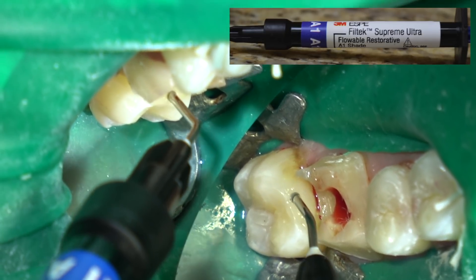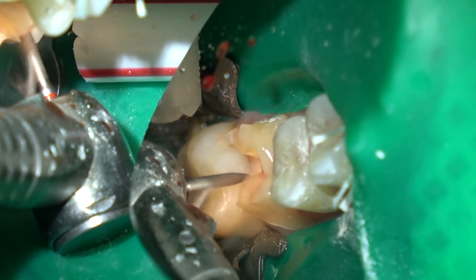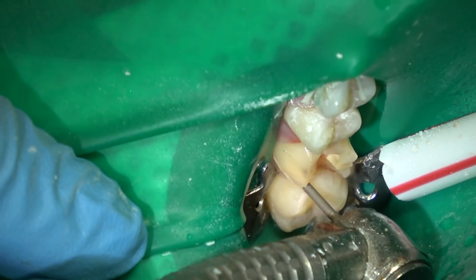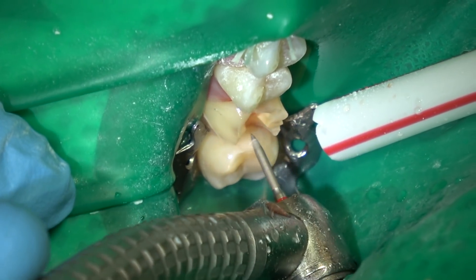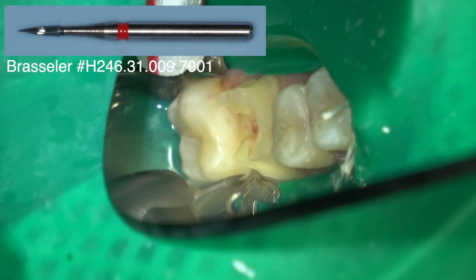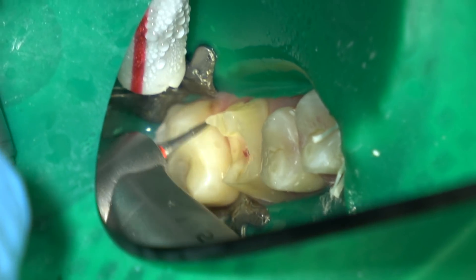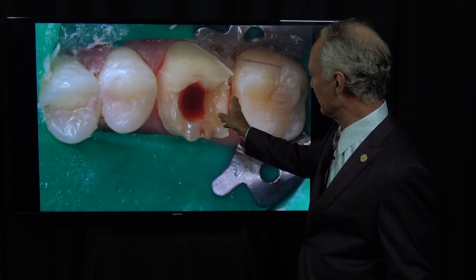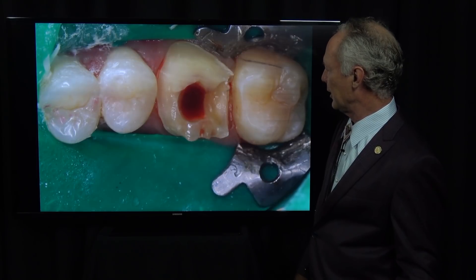Now I'm placing a flowable composite — I like Filtek, for no particular reason, just because I've used it and it works. Then I cured that. I'm polishing with a flame-shaped diamond and then coming back with a 12-fluted carbide burr for the final polish. Here's the composite — I could place it here because I gained access when I prepped the tooth for a crown.